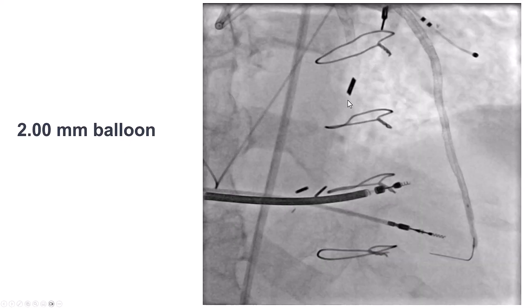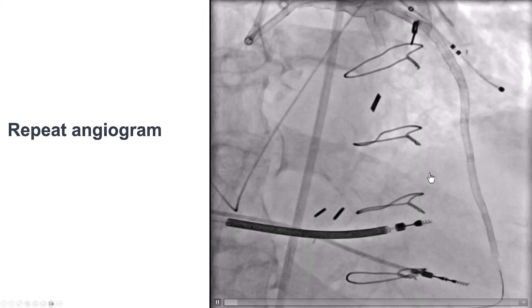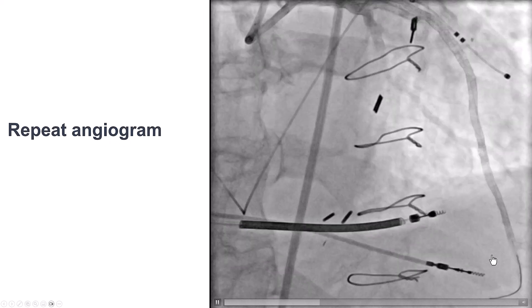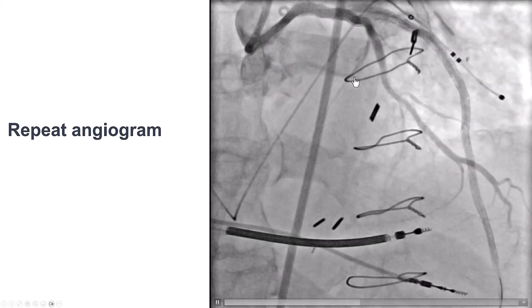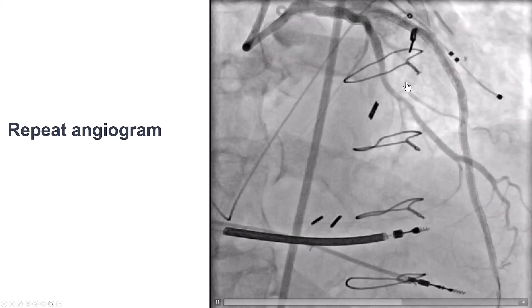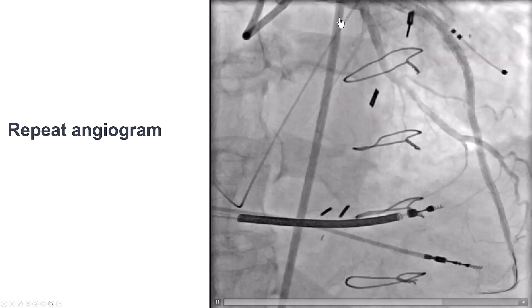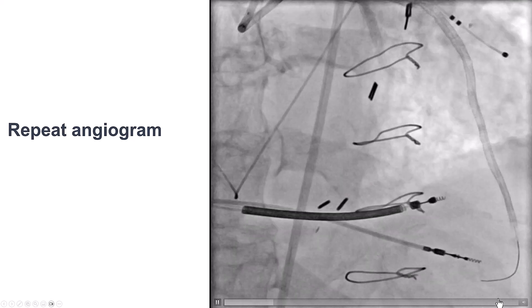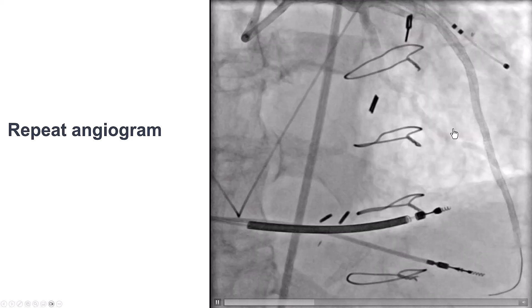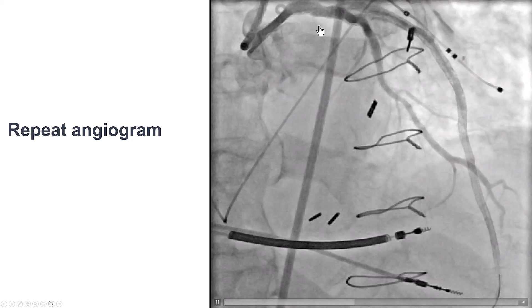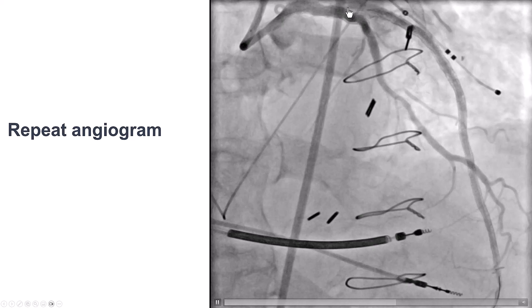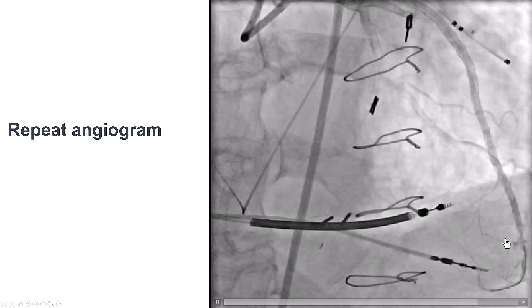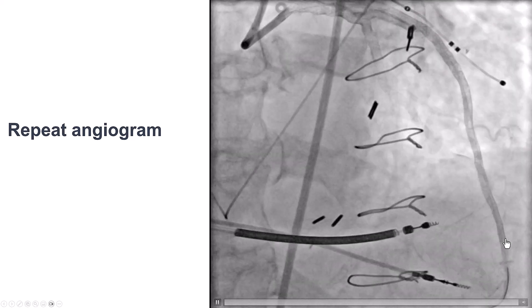So what we did is we predilated even more, especially the exit point. And now we were finally able to see some flow going through the LAD stent all the way to the distal LAD. We still had some filling defects in the proximal and mid-LAD as well.